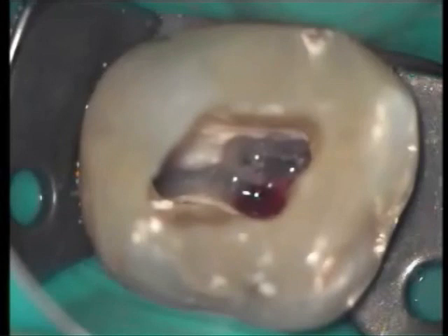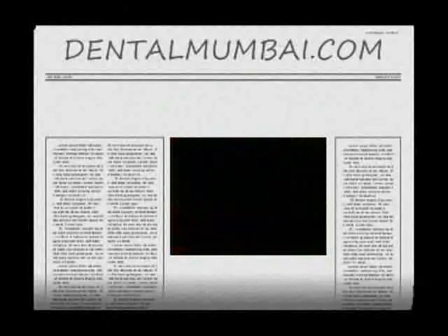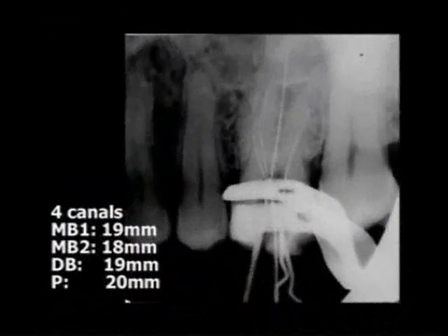The working length is determined by means of an electronic apex locator. For the sake of demonstration, a tooth-length radiograph with instruments in the four canals was also taken.